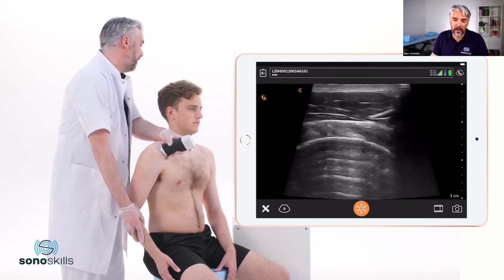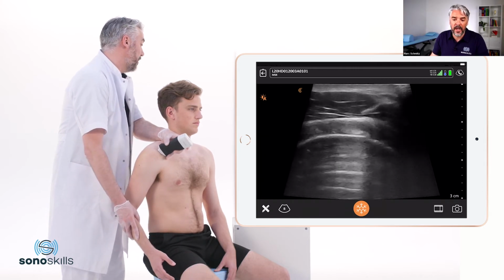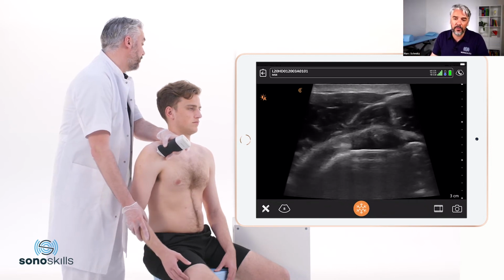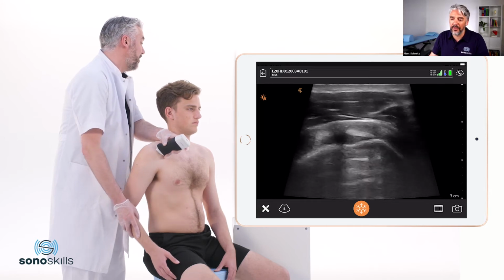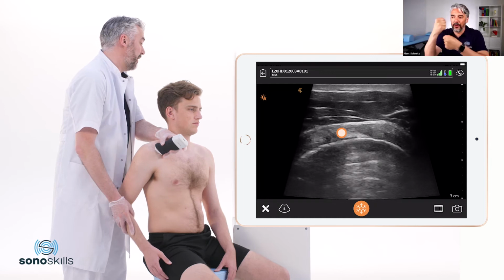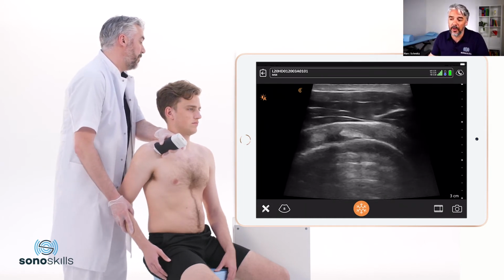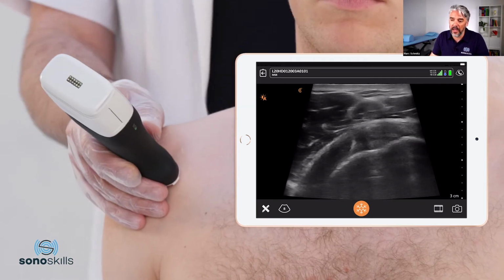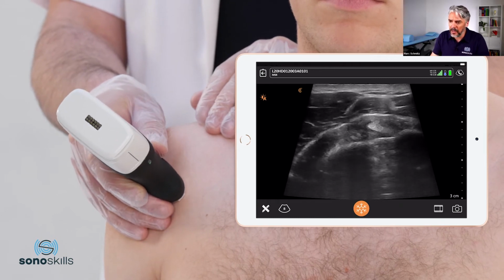So what I'm going to do here is take the patient's arm, bring it into extension, and move the shoulder in extension, but also internal and external rotation. What we want to see is that the long head of the biceps follows the humeral head. We don't want to see counter movements, because that would mean instability of the biceps, and a tearing of the supportive structures.